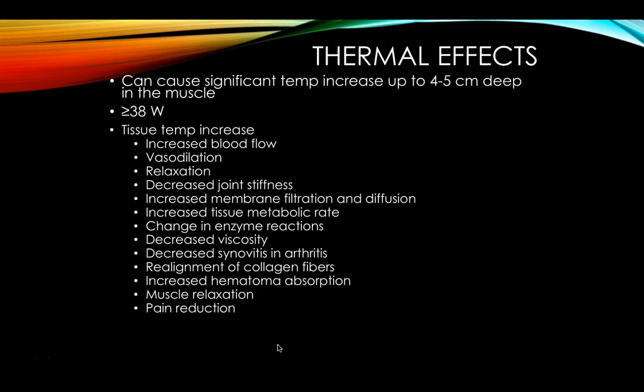So then our thermal effects, we can cause significant temperature increases 4 to 5 centimeters deep in a really large volume area. Again, think that cereal bowl. Anytime we're greater than our 38 watts. So these then become all of our same thermal effects, right? So when the tissue temp increases, we get this whole list of effects to the body.